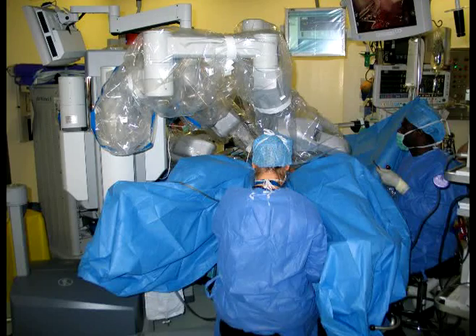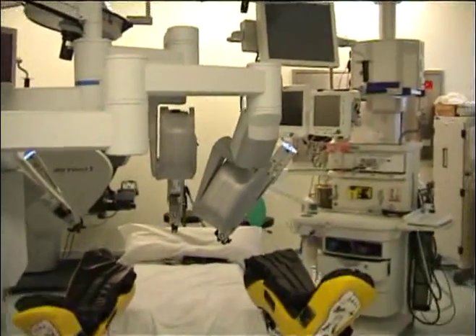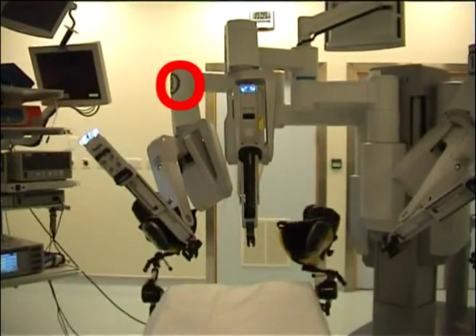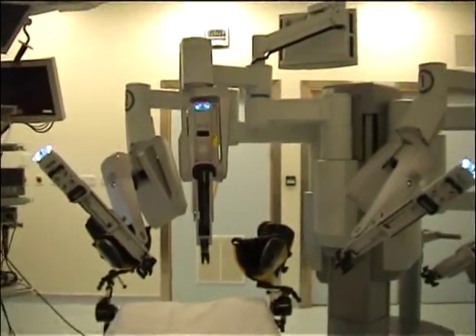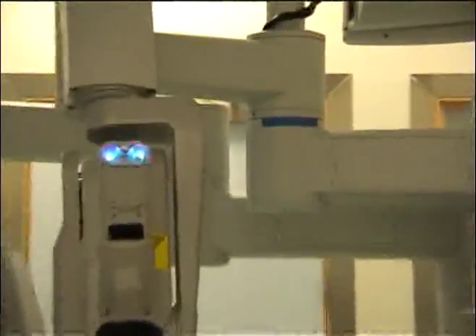Arm 2 is placed as demonstrated, forming an arch over the area in which the between-the-legs assistant is seated. Note the number 2 is facing to the left lateral. The camera arm is placed in the midline. Note the blue arrow is not in the sweet spot.